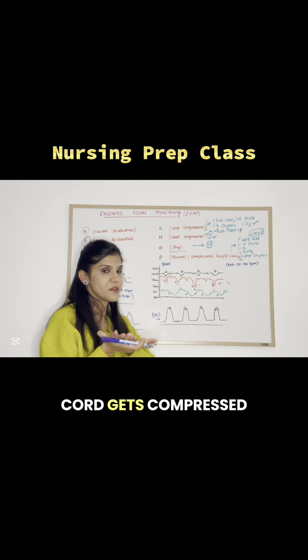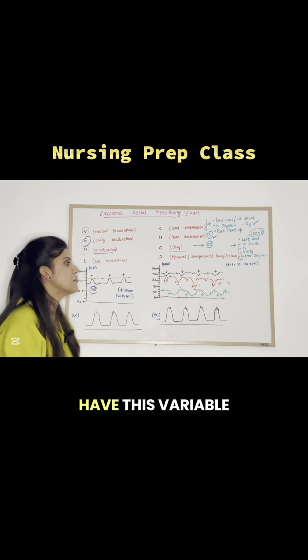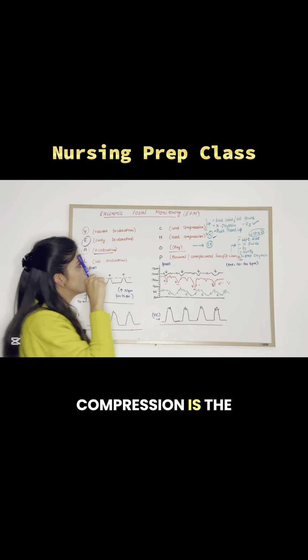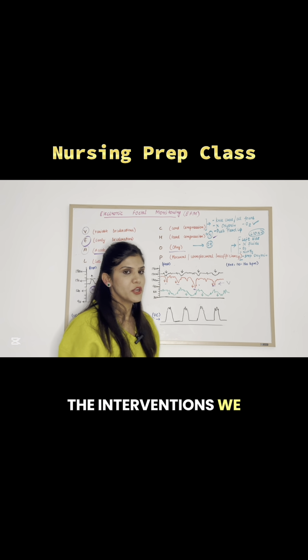And if the cord gets compressed, the blood supply will be seized. As a result, the baby will have this variable pattern of decreasing heart rate. So the cord compression is the reason behind variable deceleration. Now, what are the interventions we can do for this?